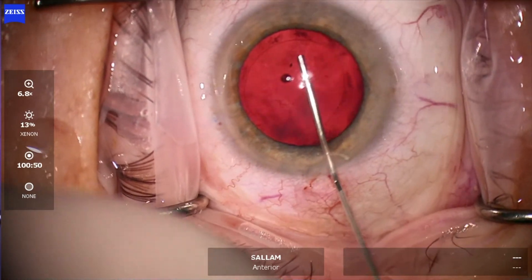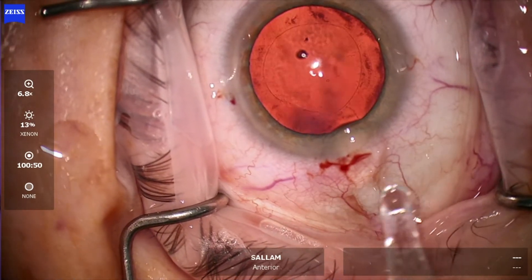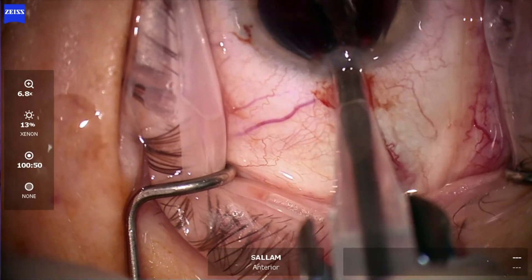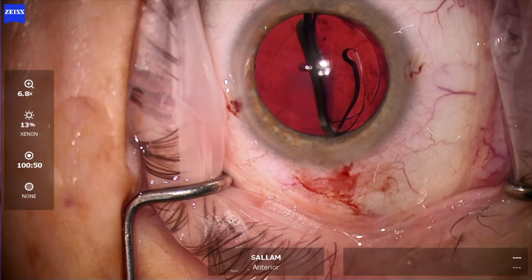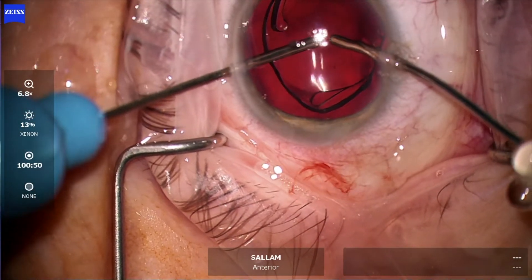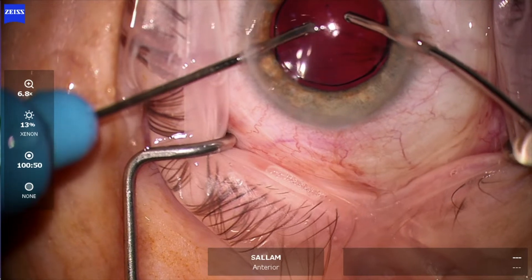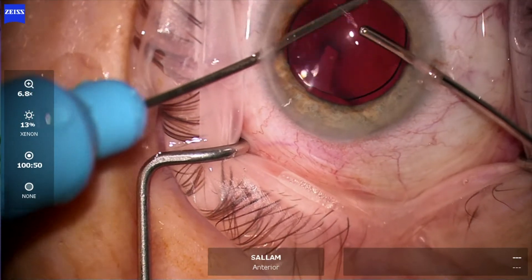Now Provisc to fill the capsular bag, and the rest is pushing the lens in, so I'm using a wound-assisted technique. My advice is to push against the cornea until the lens is halfway, then you can relax and see where the lens is going. Now using the bimanual irrigation-aspiration system as a second instrument to get the lens in the bag and removing the viscoelastic from the anterior chamber.